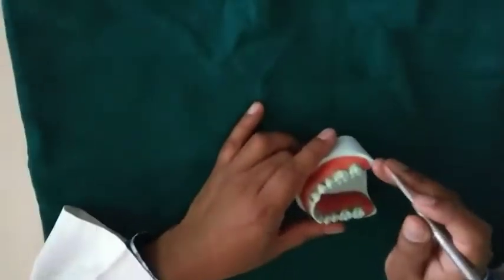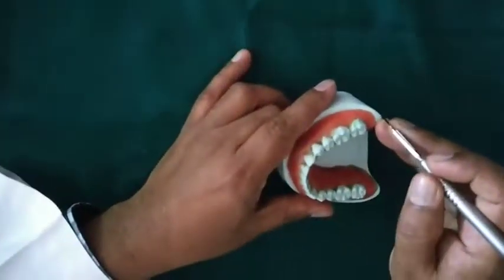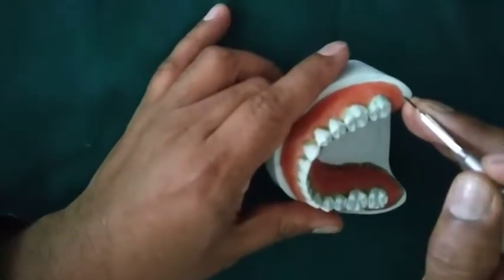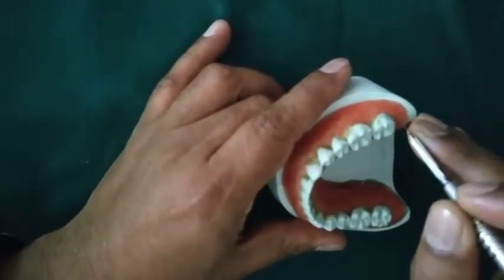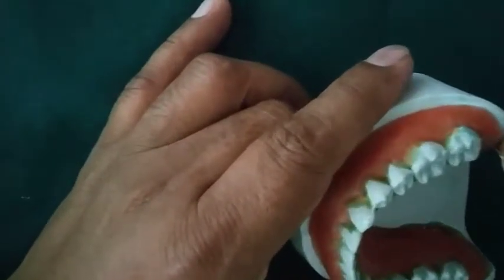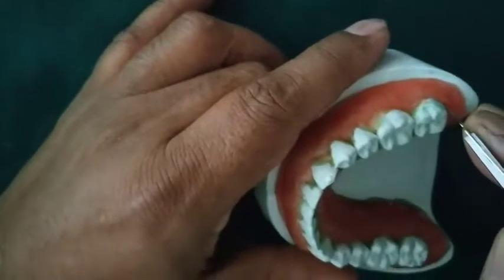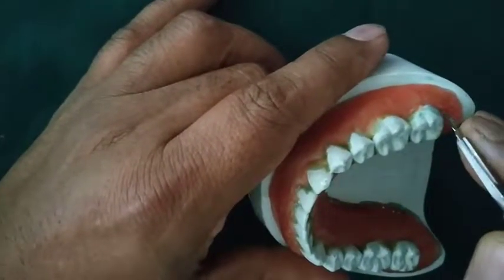The first incision is the internal bevel incision. The internal bevel incision is given with a number 15 blade. It starts from 0.5 mm from the margin of the gingiva, and the blade is directed towards the crest of the alveolar bone. We start from the distal end of the teeth.